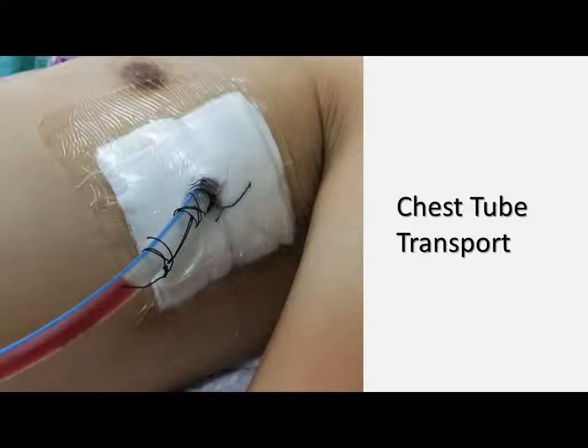Hi guys, in this video we're going to have a look at the management of patients with a chest tube in situ. We'll have a look at some of the physiology associated with chest tubes and some of the troubleshooting and just general care and maintenance that you might need to perform while you're transporting these patients either between hospitals or from an air ambulance.